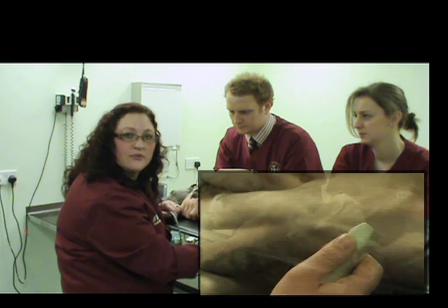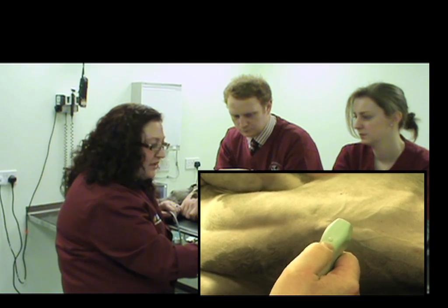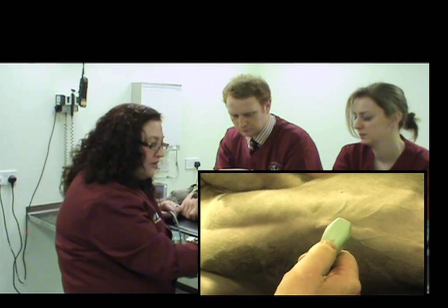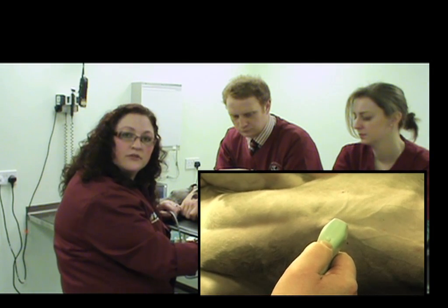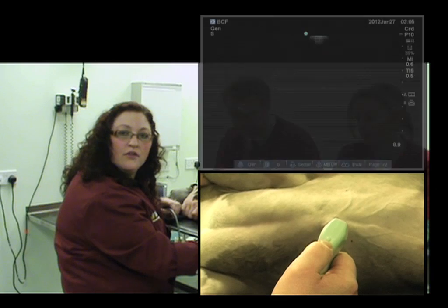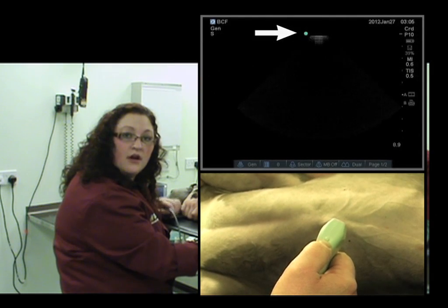So the first thing we'll look at is our grasp on the probe. On most probes, there will be some sort of indicator — the thumb notch, the finger notch. Sometimes it's a groove. And this corresponds with some sort of indicator on the ultrasound image. In this case it's a blue dot on the side of the image.